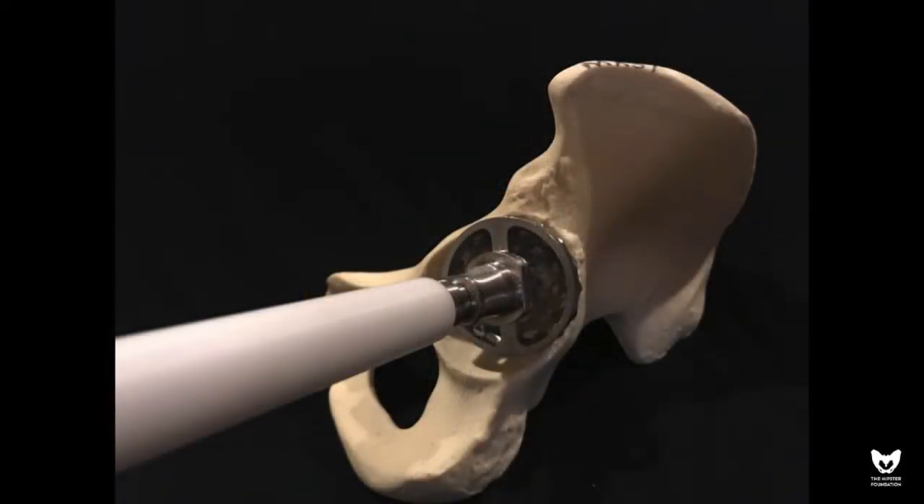We immediately introduce the similarly sized reamer into the acetabular defect — not to medialize and prepare for an acetabular component, but rather to decorticate the bone and achieve punctate bleeding, ensuring good biologic preparation of the bone for accepting a graft.